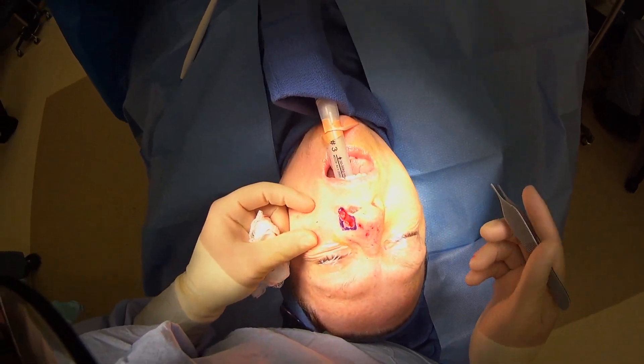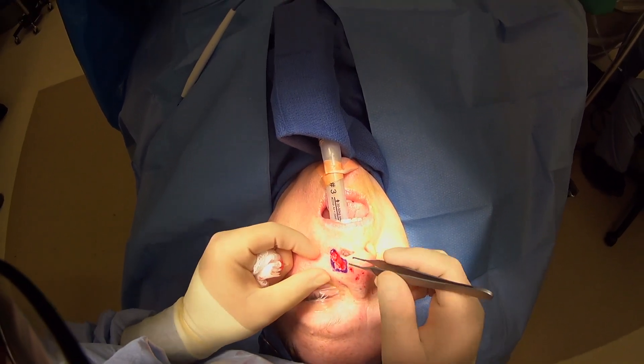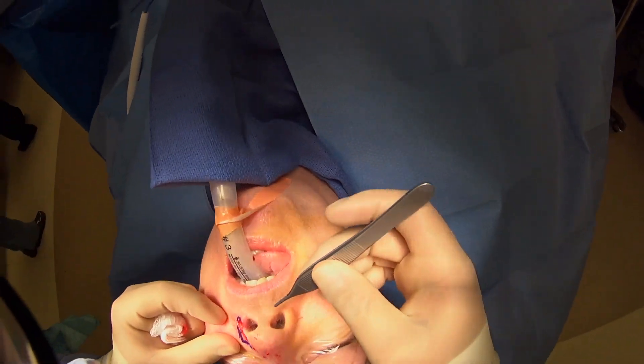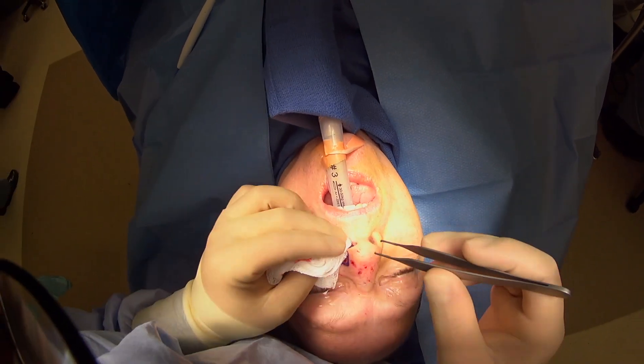Here we are doing a nasal reconstruction. She has a large defect from a skin cancer and had most of it excised. The reason we're doing a forehead flap for her is, as you can see, it comes all the way to her nasal ala and this is very thin and floppy here.